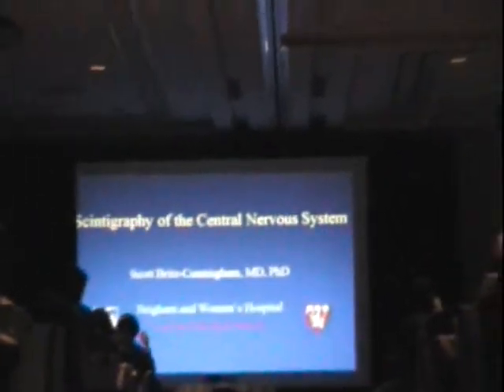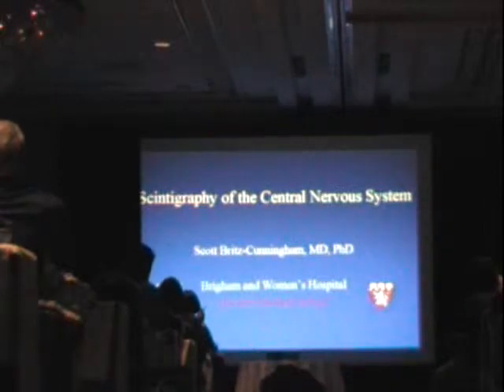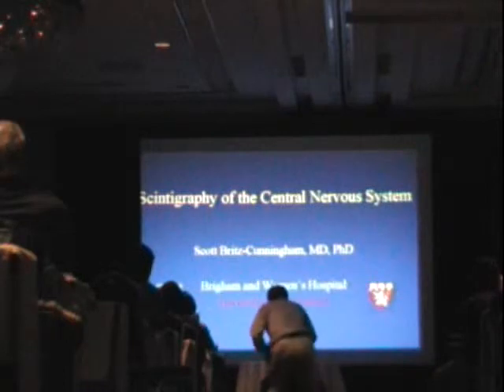They're pretty much interchangeable. There are some slight differences in the appearance of the images. With the ECD, you get a little bit better signal to background ratio. With HMPAO, the main advantage is that the uptake at very high flow levels is more proportional to the level of flow. So in patients that have high uptake lesions, like in epilepsy, for example, you have a little bit more sensitivity in finding those lesions with HMPAO. But it's really just a marginal difference.